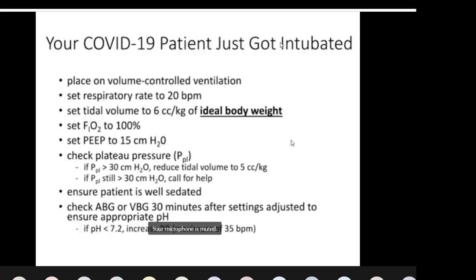So to conclude my talk, a man without principles and will is like a ship without a compass. I think it's similar to putting a patient on mechanical ventilation and not doing an ABG. You might have set your parameters, but you don't know what parameters are attained in the patient. You might have sedated the patient, you might have given analgesia to the patient. We don't know what physiological change you have produced, whether you are doing good to the patient or not doing enough good. So managing a ventilated patient, ABG is a must, and a regular ABG is what would make you tune the ventilator properly.